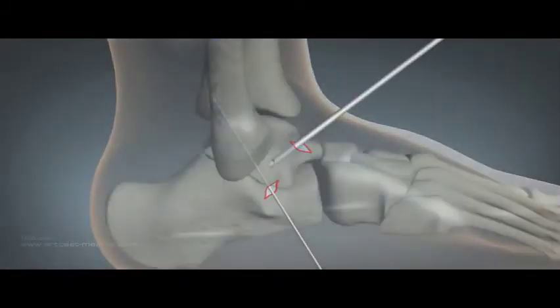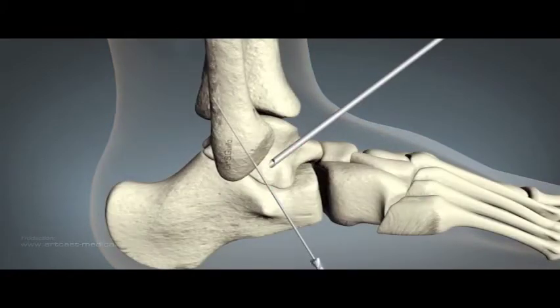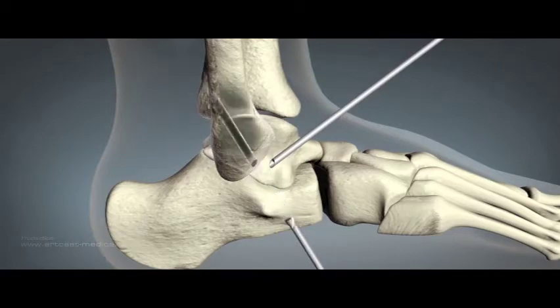From an accessory inferior portal, a guide wire is placed onto the common ATFL-CFL attachment under direct vision. The initial 4.5mm tunnel is overdrilled with a 6mm drill at the distal insertion.